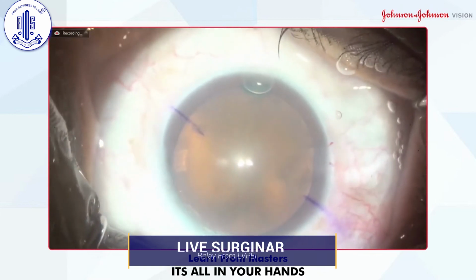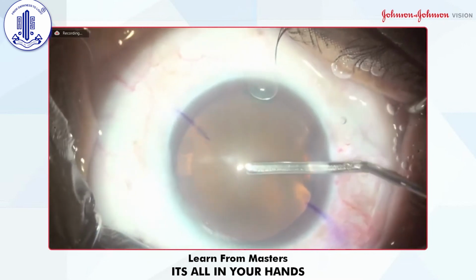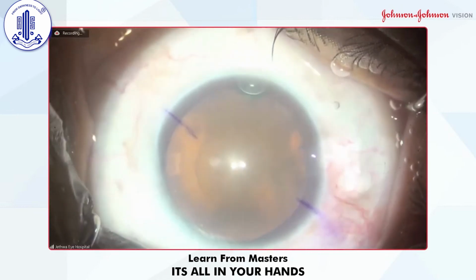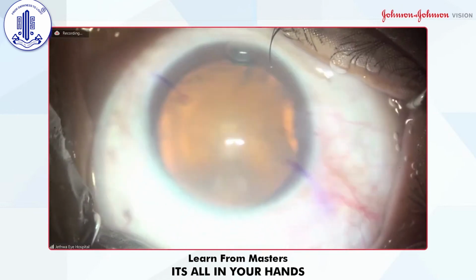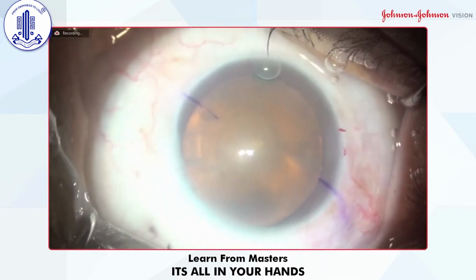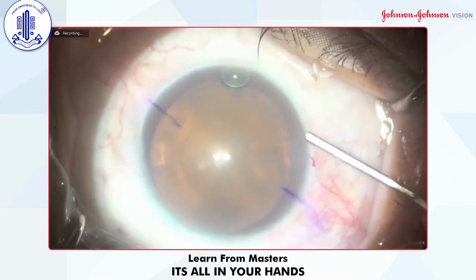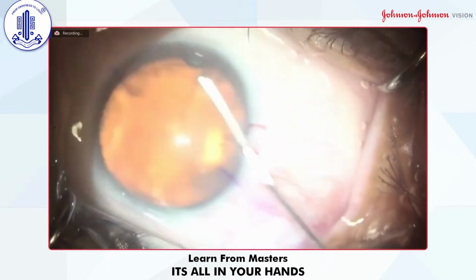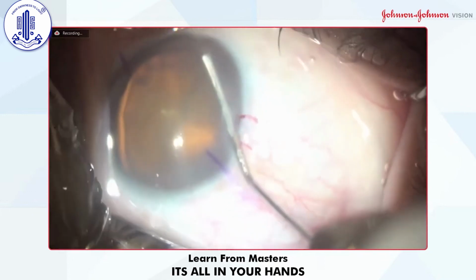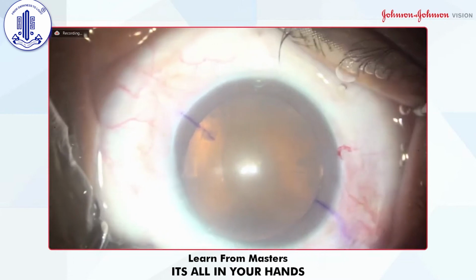and in this case, I have used Hilon, and below Hilon, I'm injecting the methylcellulose hydro. The reason is that I'm more comfortable in Rexis when viscoat is over the capsule. Okay, I think this is enough. Hilon.